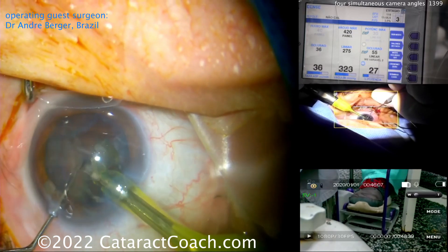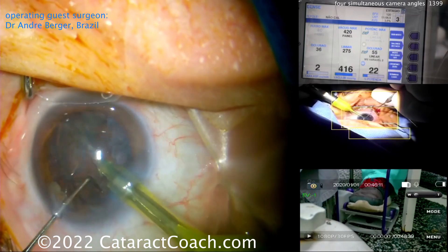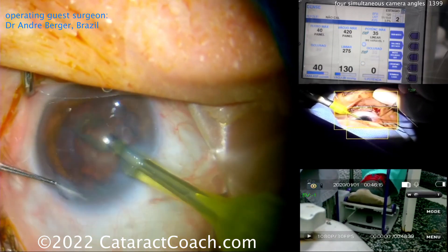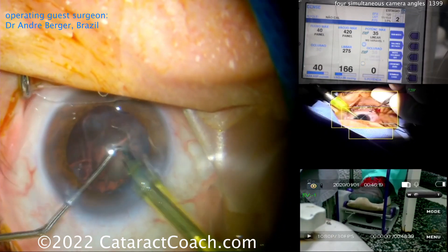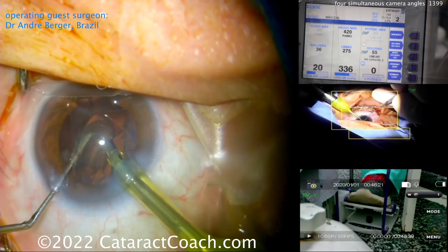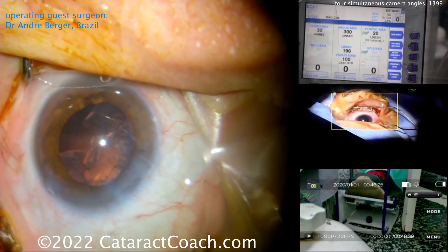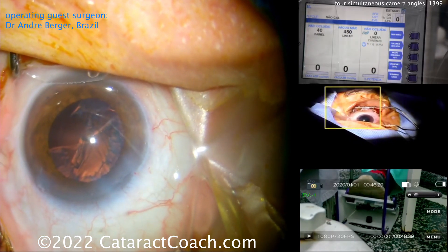Here come the last bits of the nucleus coming out of the eye. Again modulating that foot pedal — a little more gas, a little less gas, a little bit more on the pedal, a little bit less. It's like driving a car. He's doing a beautiful job. Last piece coming up, chopper in the safe position, switching over to I/A — you see what he did with his foot? He used the foot pedal to switch over to the next mode.